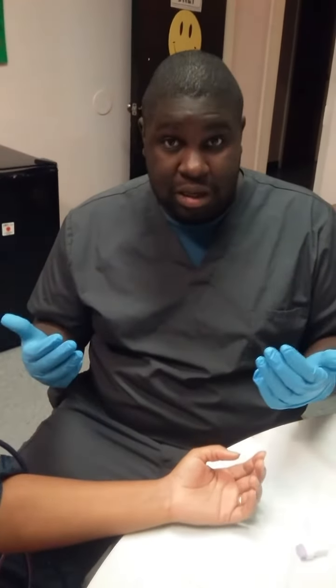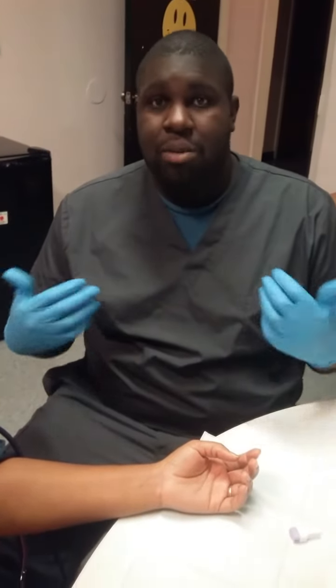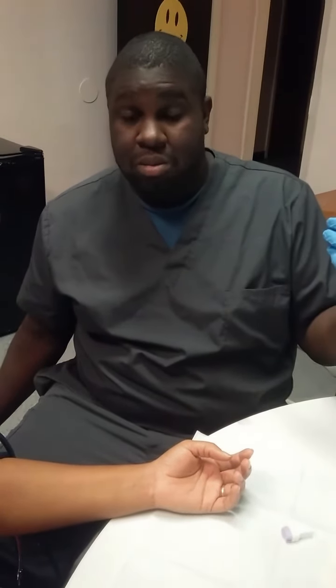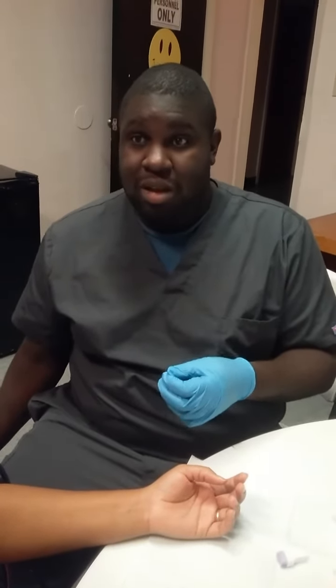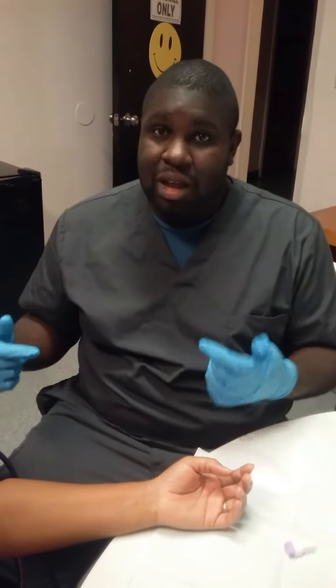There could be some platelet dysfunction there, or some other genetic factor or abnormality that may keep her body from clotting. Anything over 15 minutes, that's critical. You need to stop the test immediately and have them apply pressure, because then there's something wrong with her platelets, with her clotting, things of that nature.